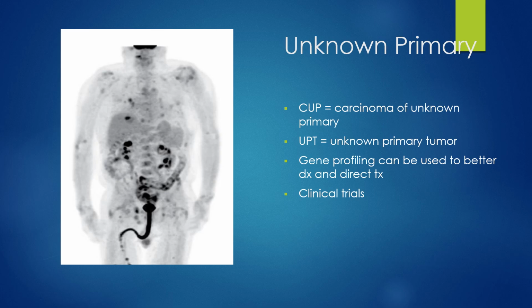I've actually seen a patient like this before, and it turns out that they had this very, very rare cancer that only occurred in veterans who had worked with a certain chemical during combat. And it had some weird, really long name to it that I'd never heard of. It wasn't really in books. So if a patient presents with a cancer like that, sometimes it's very hard for the doctor to figure out the diagnosis. And FDG scans can help rule out or confirm other things, or even help narrow down the search by seeing if it's FDG avid or not, and helping to understand the metabolism within the tumors.